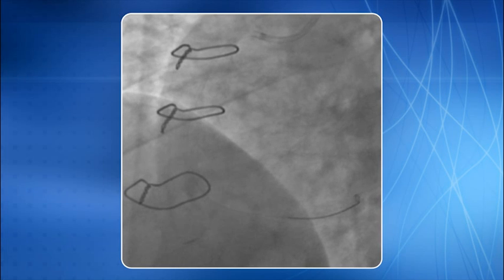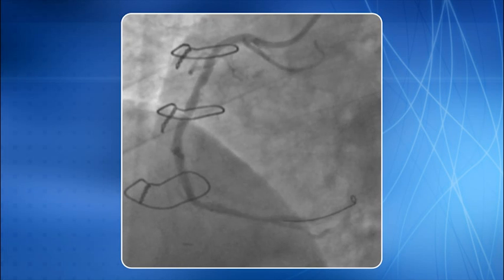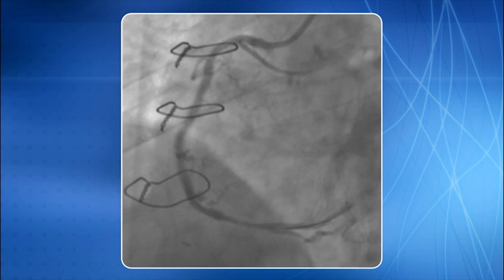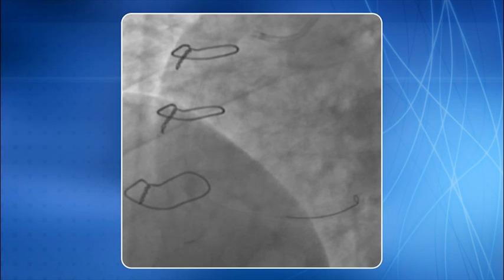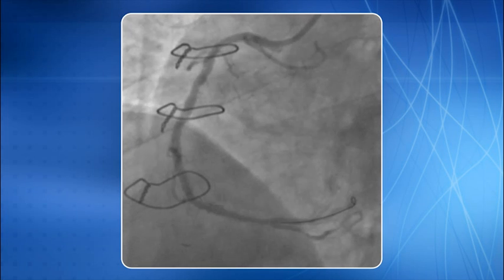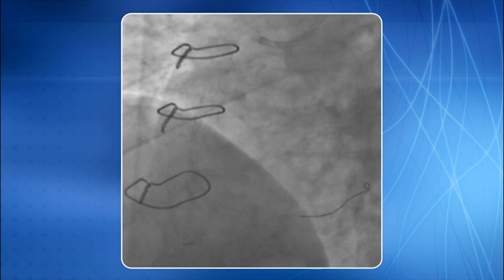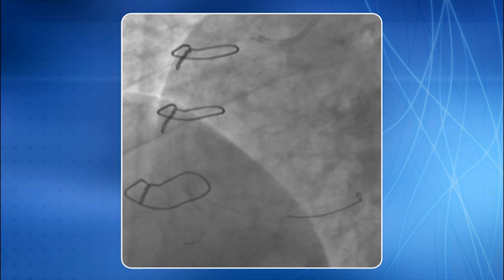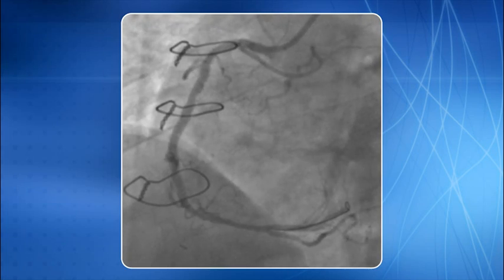RCA ostium is now cannulated and RCA intervention is in progress. Once the JL guide sits properly in the RCA ostium, it almost acts like an extra backup guide working for the left.